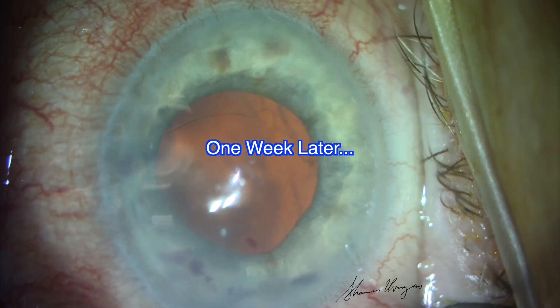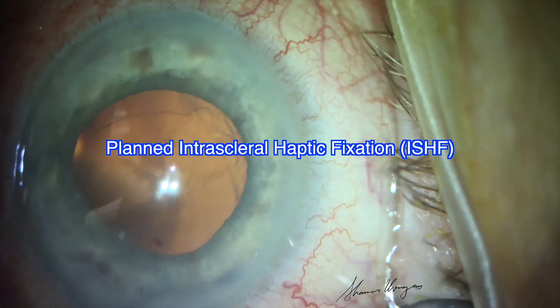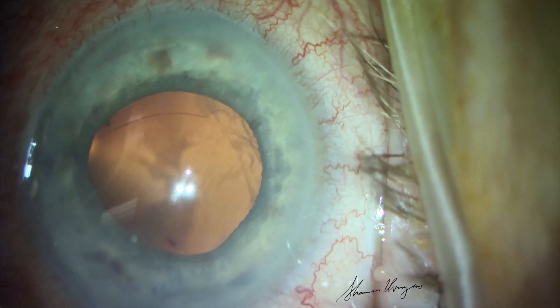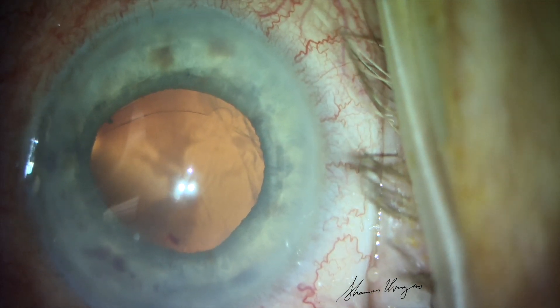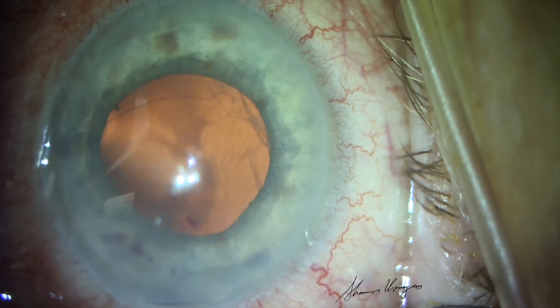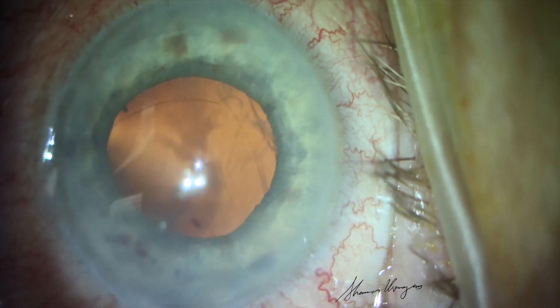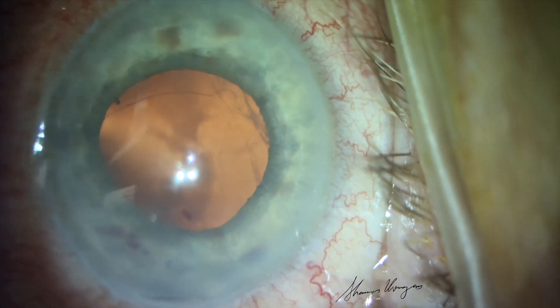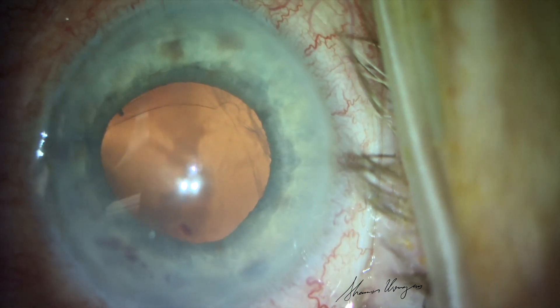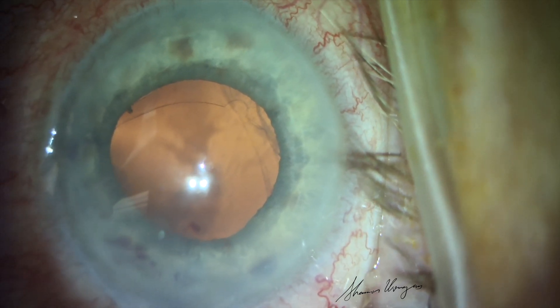One week later, we return to the OR to perform intrascleral haptic fixation. The epithelium is slightly hazy, so we choose to debride the epithelium at the beginning of the case to optimize visualization going forward. Subtenon's injection of lidocaine has been performed to help ensure that the patient is more comfortable and to mitigate patient movement of the eye during surgery.